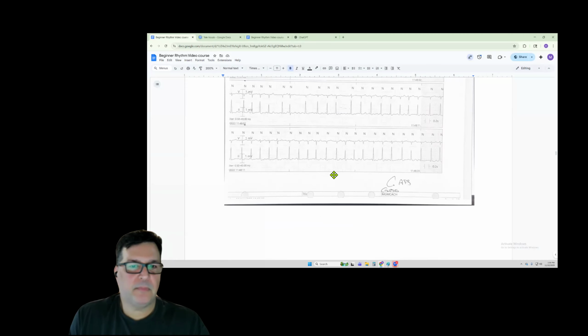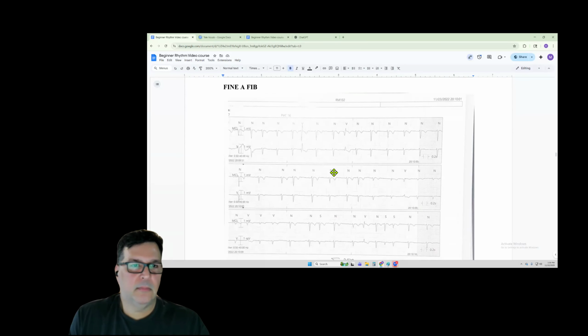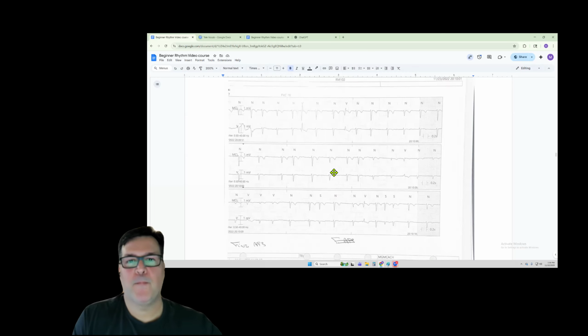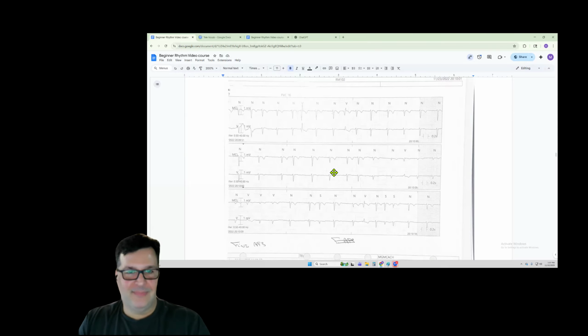That makes sense. Same with the compensatory pause. It's not just the pause or the one section alone that'll help you determine. You have to look at the big picture for both and use your tools to see what it is.